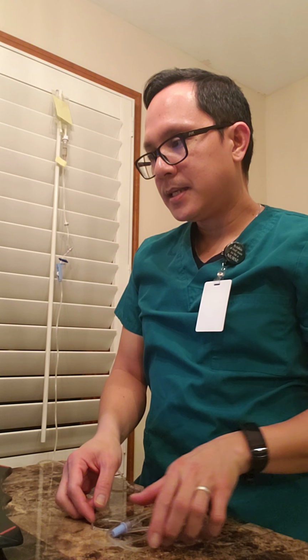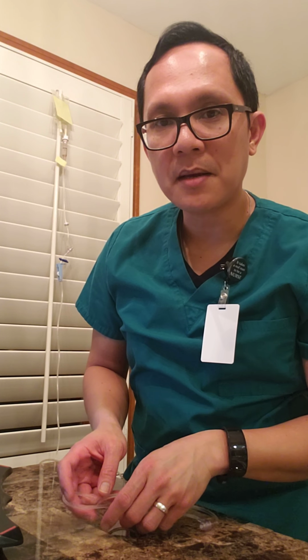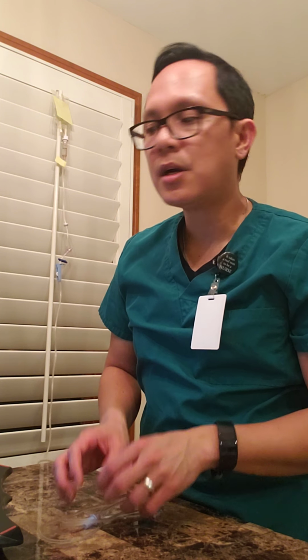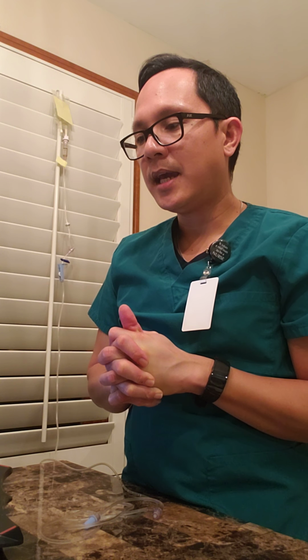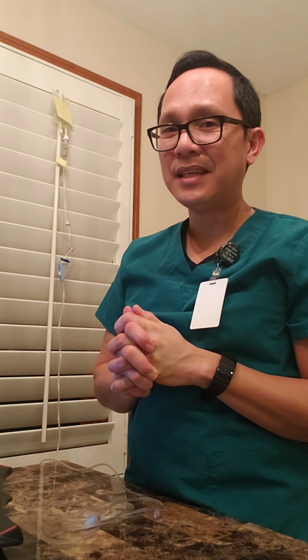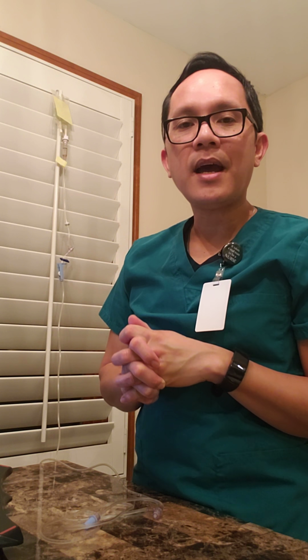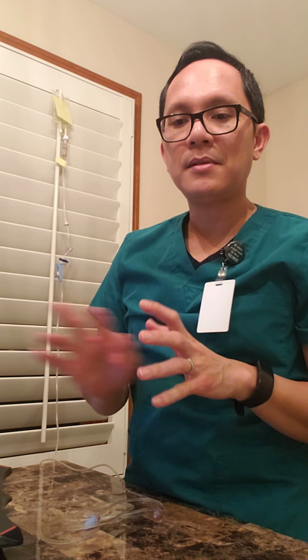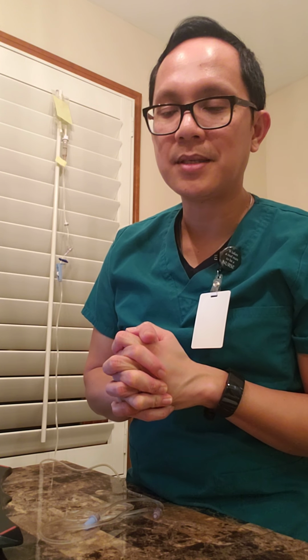Since everything is good and the patient is okay with me giving the IV medication to her, I'm gonna go ahead and give the medication. And after that, I want to make sure I gather all the supplies that are not needed and dump them in the correct receptacle.